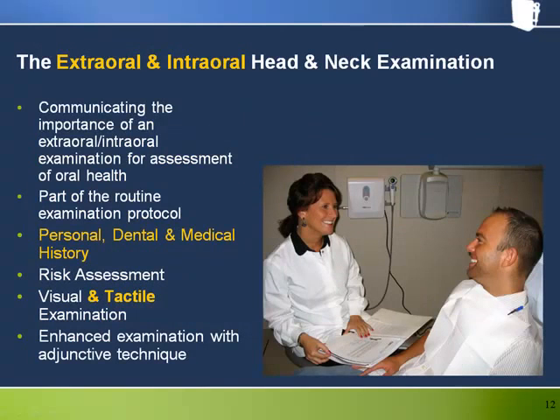Of course, the physical examinations, whether of the traditional variety or adjunctive in nature such as the VELscope exam, are themselves part of a larger oral assessment process that also involves acquisition of a comprehensive health history through such tools as questionnaires and direct patient interviews.